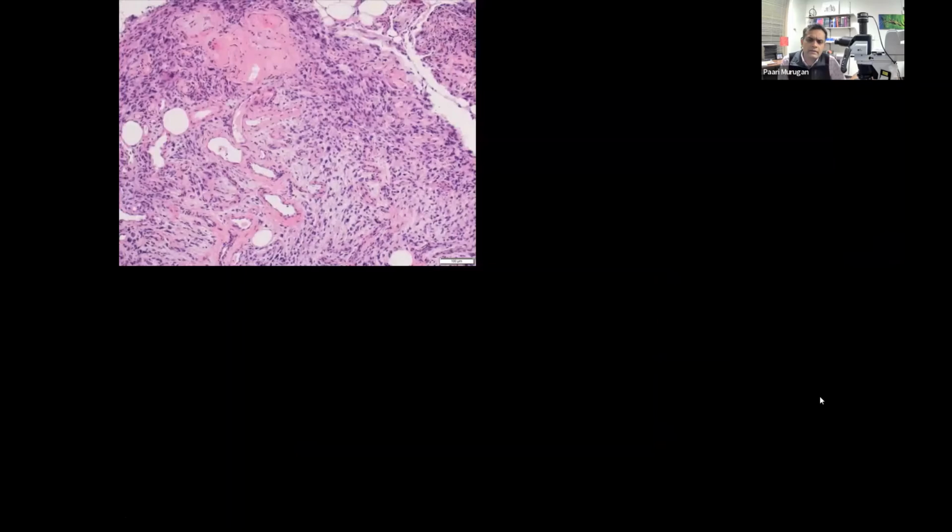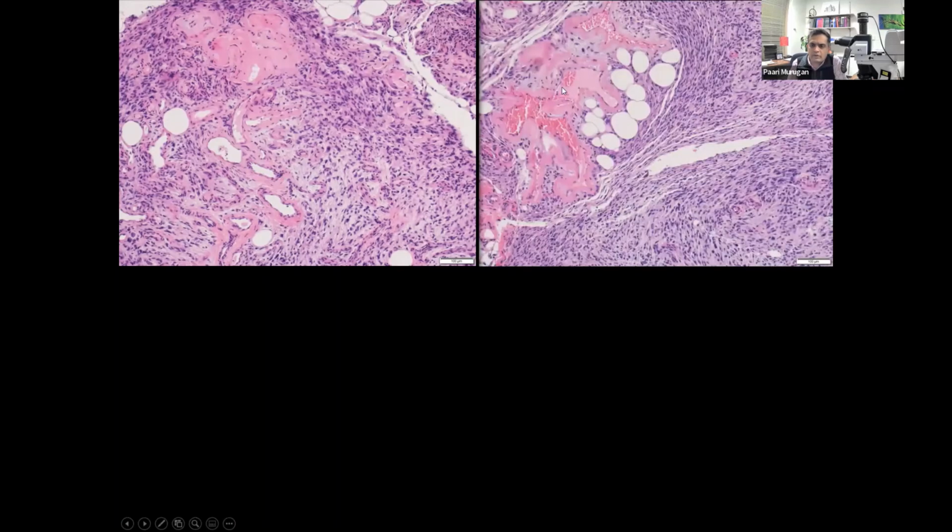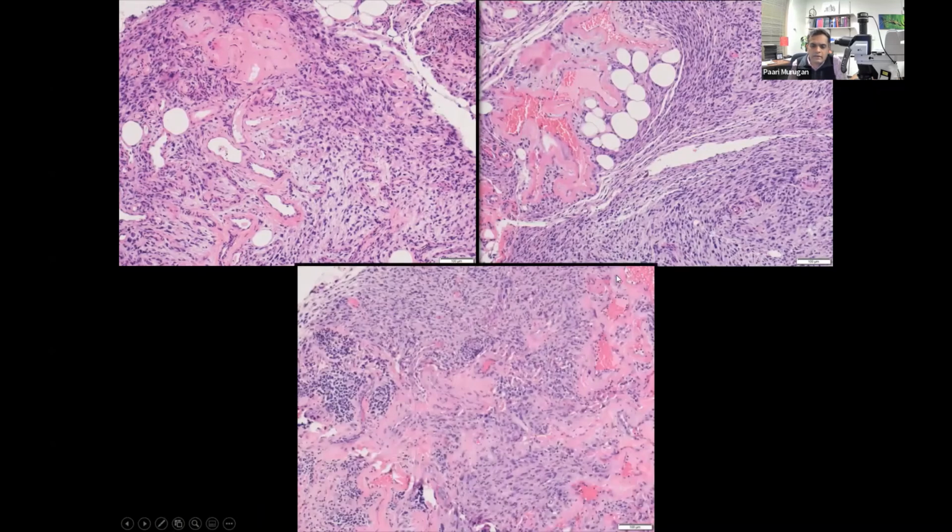And then let's briefly look at these vessels again, these characteristic blood vessels. So abnormal dilated ectatic vessels with fibrinous degeneration and hyalinization of the walls. Another image here showing the same picture, very abnormal branching vessels with hyalinized walls. And then yet another one just showing this fibrinous degeneration. And you see the spindle cell tumor in the background. And you also see a component of chronic inflammatory cells.